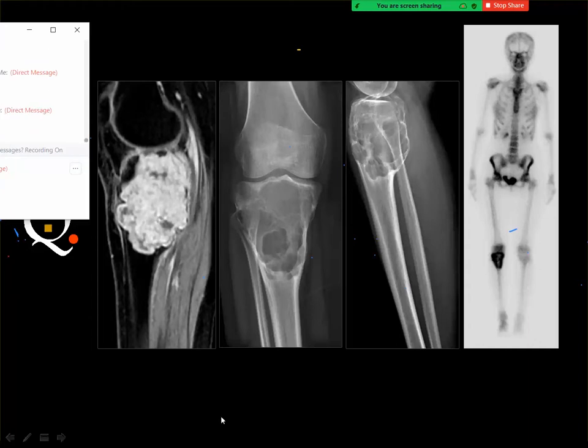Yes, and giant cell tumor is a very good answer.